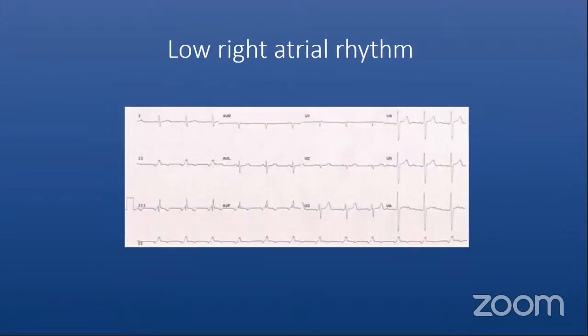And this ECG basically tells you again this is a regular rhythm. Then look at the P wave before each QRS complex. There are P waves, but look at the P wave, it is upright in that direction. And then looking at the AVF, sorry, this ECG is a little bit blurred, but you can see that this is an inverted P wave.